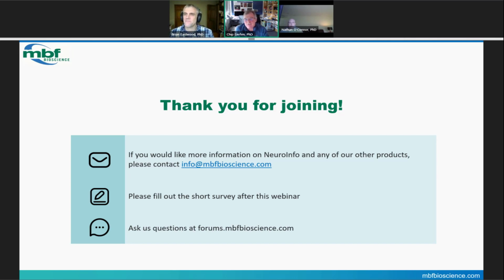But the other thing I wanted to say was that if there are questions, particularly about the histology and the tissue preparation and things like that, and the imaging, I'm happy to answer those. You can just reach out to me, Gerfen C, and you guys can send my email, because I'm happy for people to contact me directly.